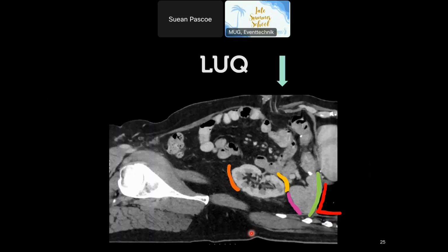And so we look at those same 5 spots. If we put our probe on at the mid-axillary line, we're in line with the spleen and the splenorenal space. We're going to rotate the probe slightly and then paint the fence. Then we need to move up a rib space so that we catch the area under the diaphragm and the pleural cavity. And from our starting point, we move down a rib space to see if we can see anything around the lower pole of the kidney and in the paracolic gutters.